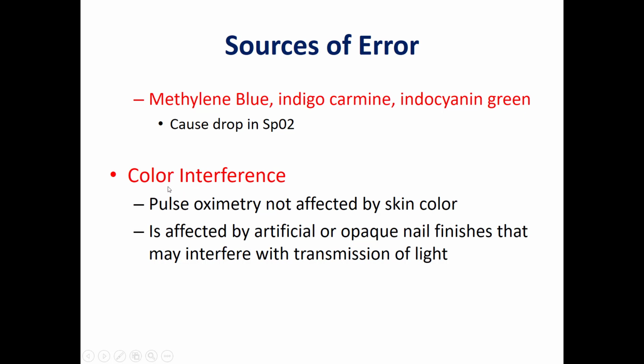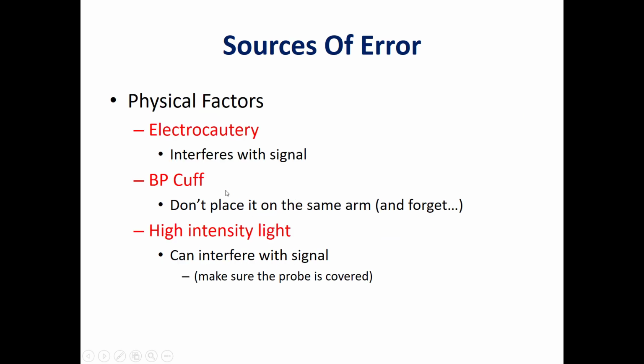Then color interference: we are not talking about the skin color of the patient, but about the use of finishes like nail finishes and other types.